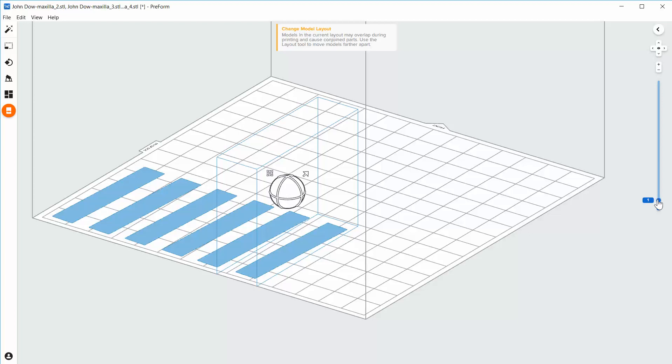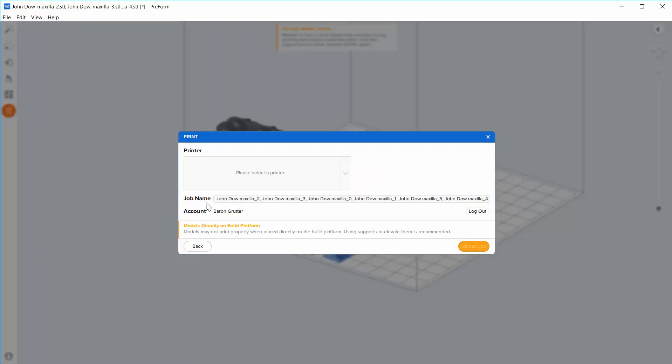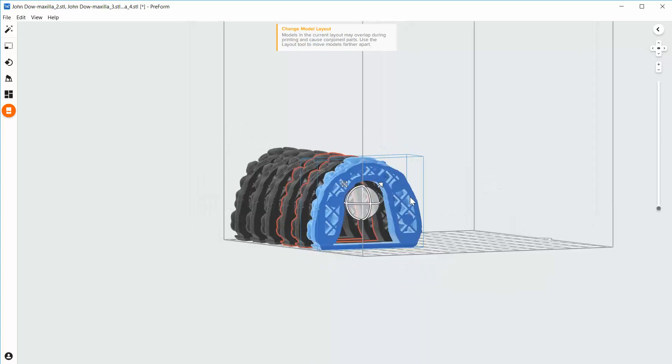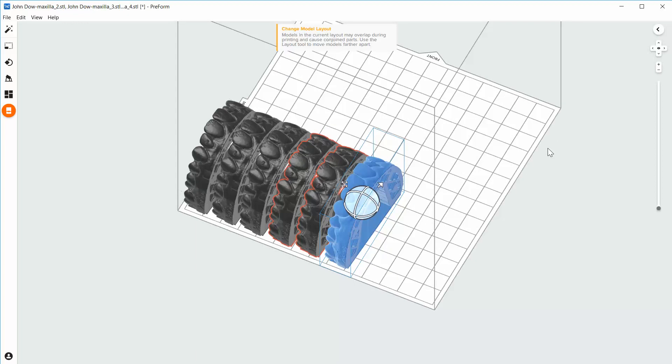Let's bring this back down so you see the whole thing. We are now ready to print. Press the print button, make sure your printer is selected, and go ahead and hit print. This is a virtual printer so I can't really show it, but that is the approach. It's very simple — just drag and drop them in, select the base, line them all up, and hit print. Hopefully that video helps.